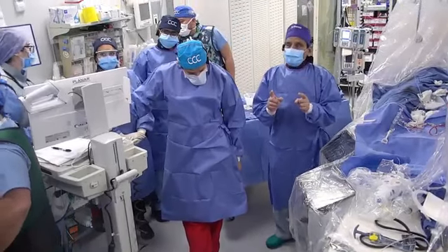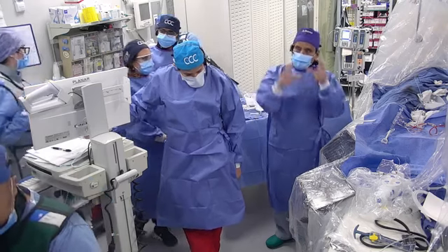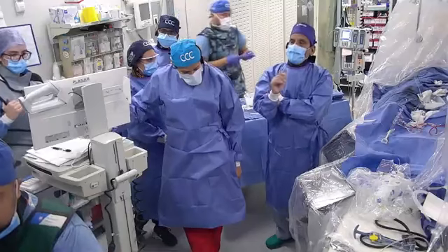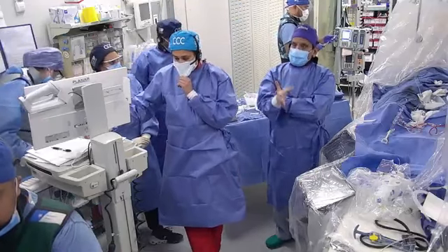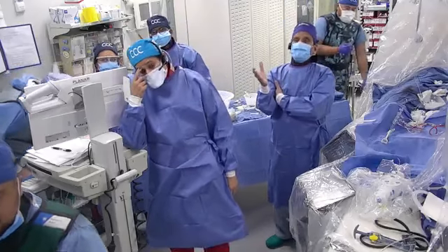To me, first preference will be IVL, if you can get IVL there. If you think that IVL cannot go because of tortuosity, then my clear-cut preference will be a small rota burr. And now after Eclipse, I can clearly say that rota will not increase more slow flow. And our publication was the same.